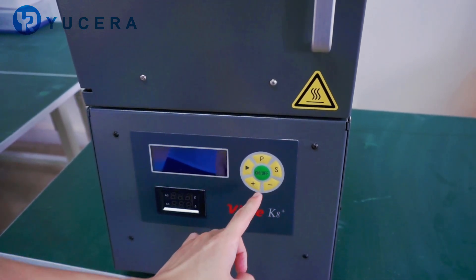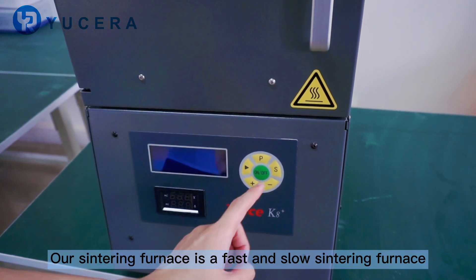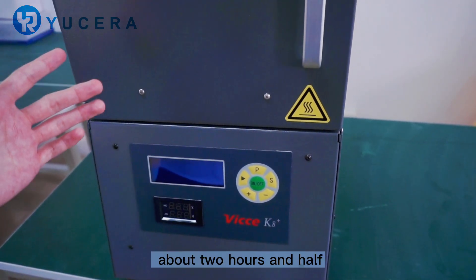It can set 20 sintering curves. For sintering, it's a fast and slow sintering, and the first program can be completed in about two hours and a half.